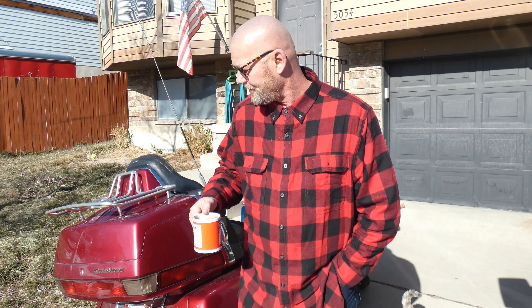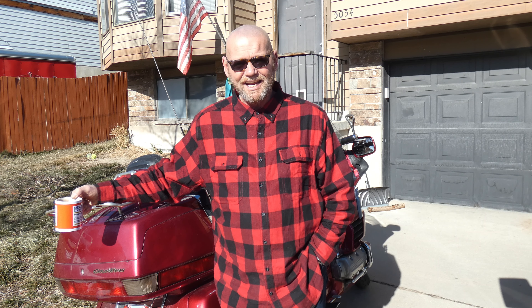You get to see my face the way it really is. Real quick, before I get too far into things, I want you to see my dentures. You'll notice in some of my videos my dentures looked a little dark — that's just the camera, that has nothing to do with stains or anything else. When I'm in natural light my teeth are beautiful. My teeth are four years old and I've never had any stains or discoloration.